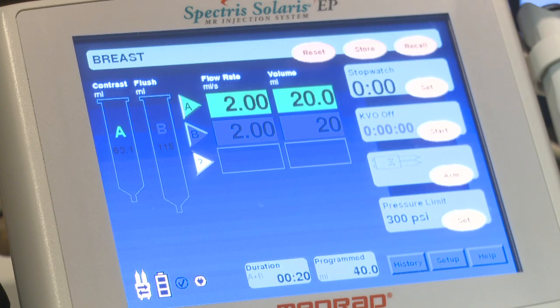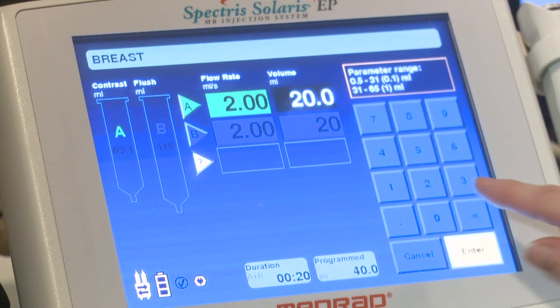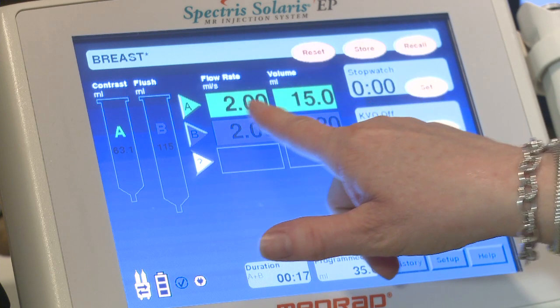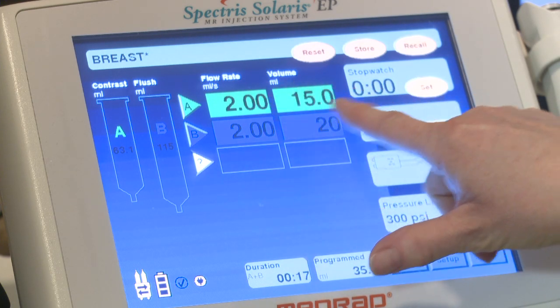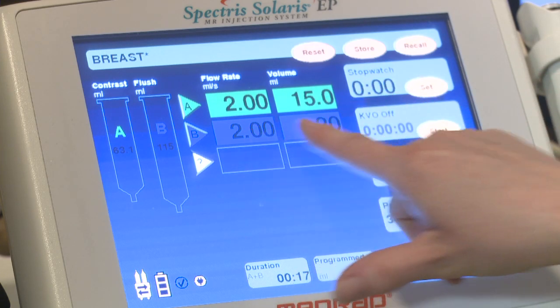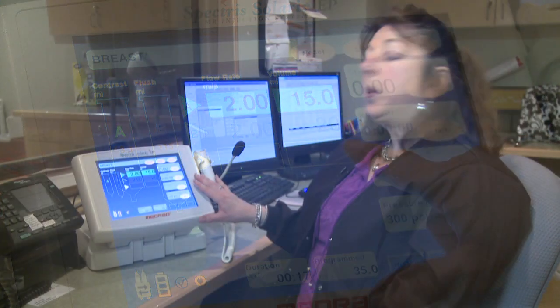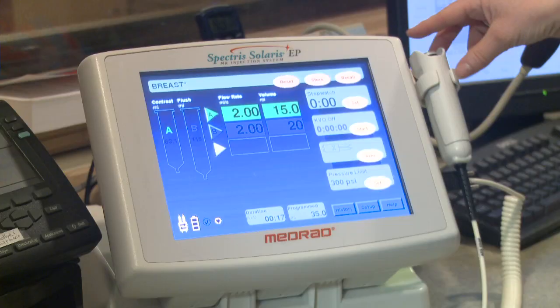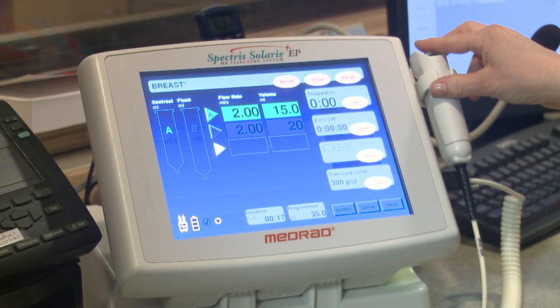This is our power injector. What's nice about this feature is that it allows us to deliver contrast material at a certain rate in a certain amount of time. For the breast, we dose by weight, so we can select the volume that we want for the contrast. This will give us a rate of 2 cc's per second, dosing 15 cc's, and we're going to follow it by a 2 cc per second, 20 cc flush. When we're ready to give the injection, we can arm this, and then press down here when it comes time for the injection.